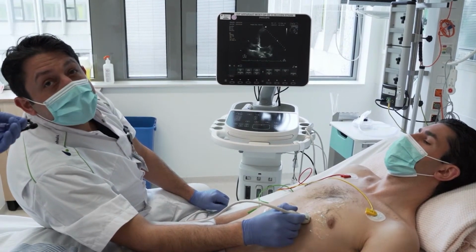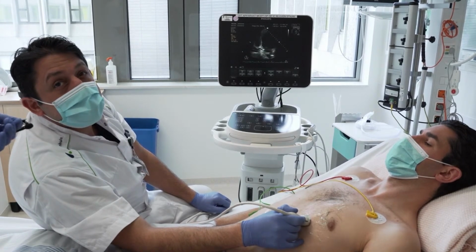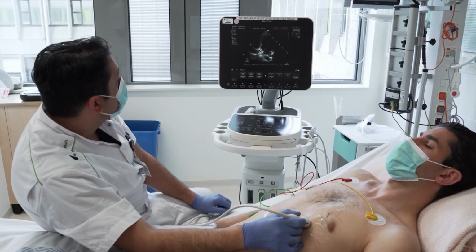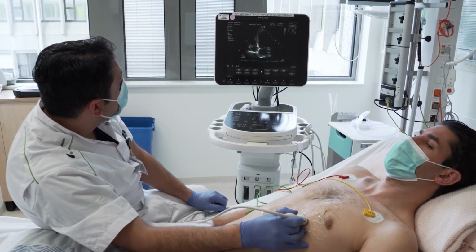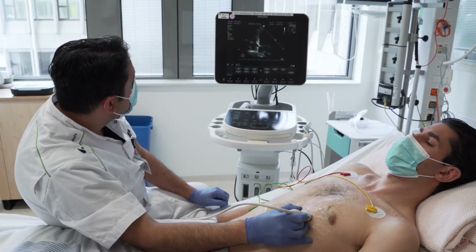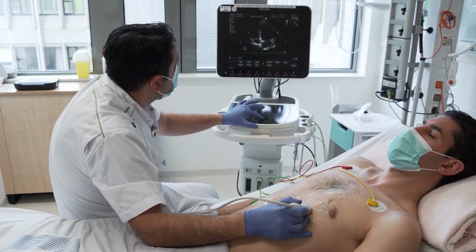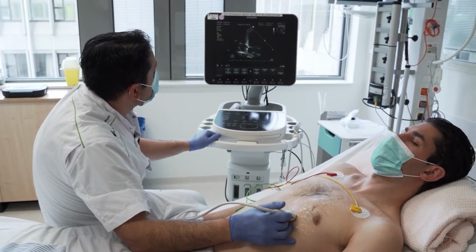And so the contractility and the wall motions you can see in these views. Yes, this is a beautiful view. Cardiologists will also put a Doppler in the mitral valve and the tricuspid valve, but I think for acute medicine this is not so important.